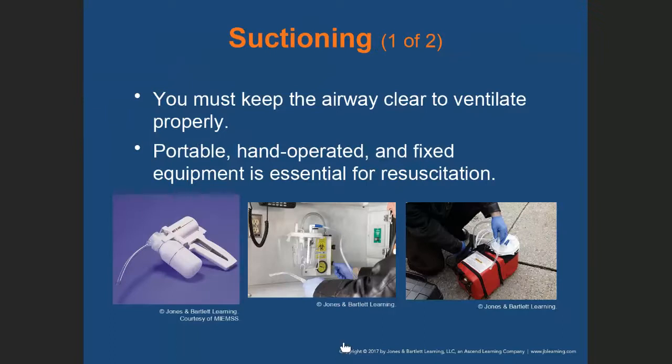All right, now suctioning. Once we position an airway, we need to ensure that it's clear. And to clear an airway, we have suction devices. If there's fluid in the airway, you're going to hear gurgling or bubbling sounds. If you're approaching a patient and you hear gurgling or bubbling sounds, or you see any signs of fluid coming out of the upper airway passage, the first thing you will do is turn the patient as a unit if there's suspected spinal injuries, or turn the head to the side if there is no spinal injury.